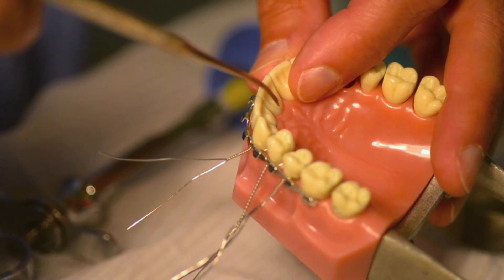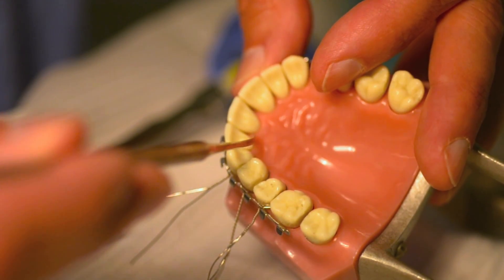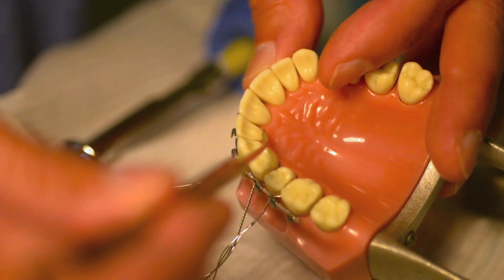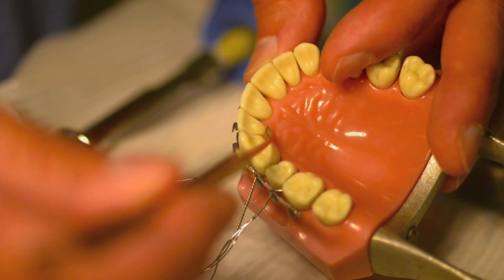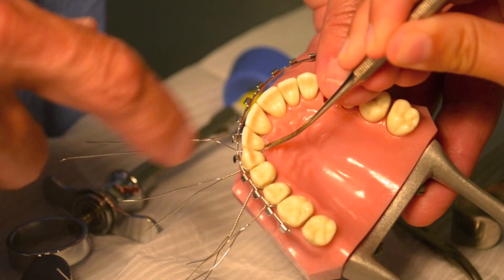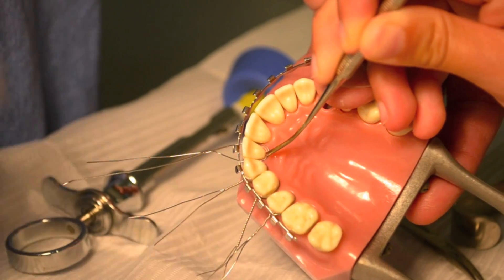When you arrive at the anterior teeth, a technical matter comes up: how do you deal with the cingulum? If, when placing your arch wires, the wire is not placed sufficiently beneath the undercut of the cingulum, as you tighten the wires down and as they loosen over time in the patient's mouth, the wire will start to ride over the cingulum and the arch bar will begin to loosen. It's very important that the wire is placed sufficiently beneath the undercut of the cingulum so it does not ride up later while the patient is in fixation. To prevent this, have an assistant simply hold the wire down on the palatal as you're tightening it.